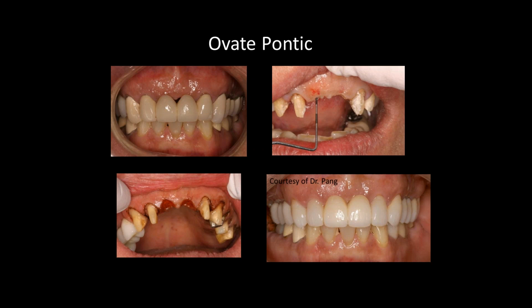And on a longer procedure like that, or if you're removing more than 1 or 2 millimeters of tissue, reapplying the topical is a good idea. Topical will last about 10 or 15 minutes, or it'll penetrate 1 to 2 millimeters. So once you trim away and the patient starts to feel a little bit, you can just re-dry things and reapply the topical.